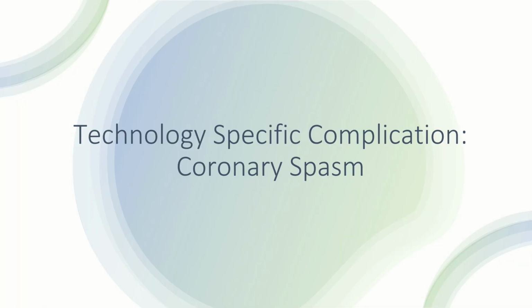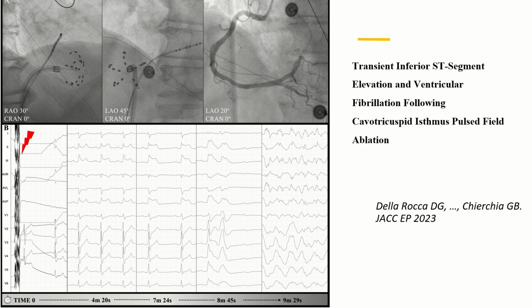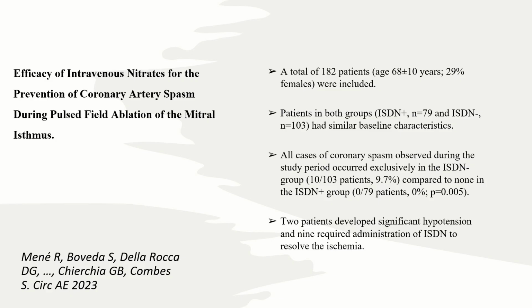I'm going to the end of my talk. Technology-specific complications: coronary spasm. This created a lot of fright at the beginning of the utilization. This is a paper published by one of our staff members, Domenico Della Rocca, showing clearly that during ablation near a coronary artery, this is what could happen. It was absolutely awful. I was in the lab at that time.